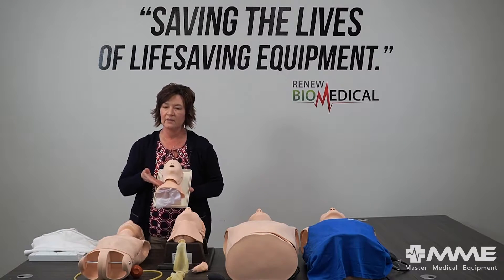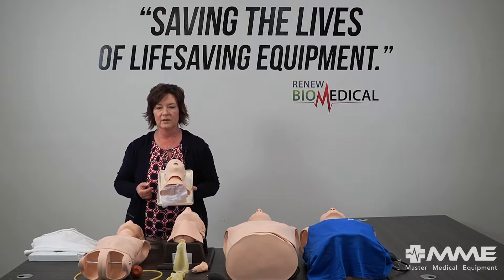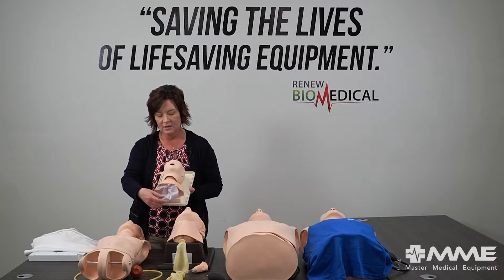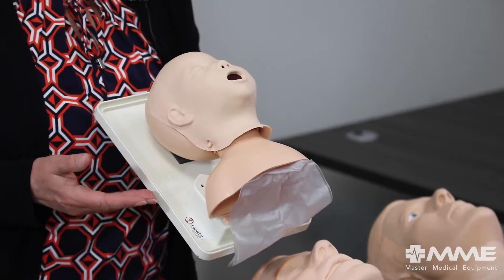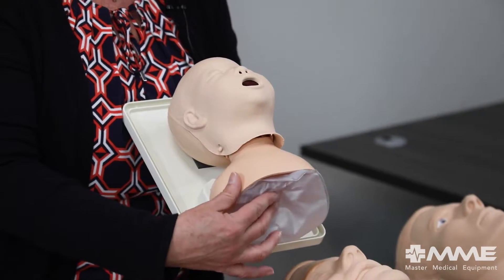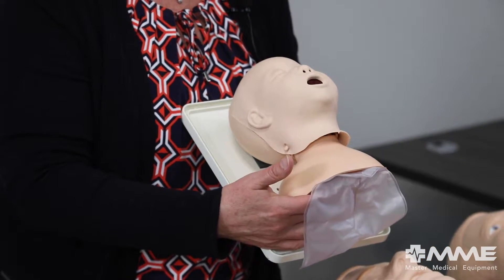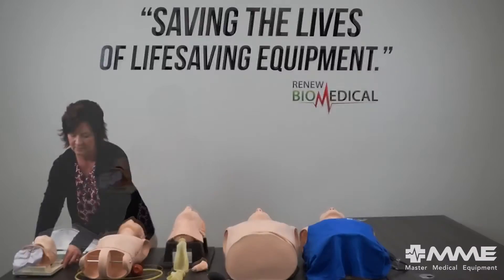Next we'll move on to our infant airway trainer, which represents a three-month-old. It has a very realistic airway and can accept any oral or nasopharyngeal adjunct you'd like to place. You also have the ability to intubate it in the esophagus, so you'll have a stomach that blows up, as well as lungs that inflate upon ET tube insertion.